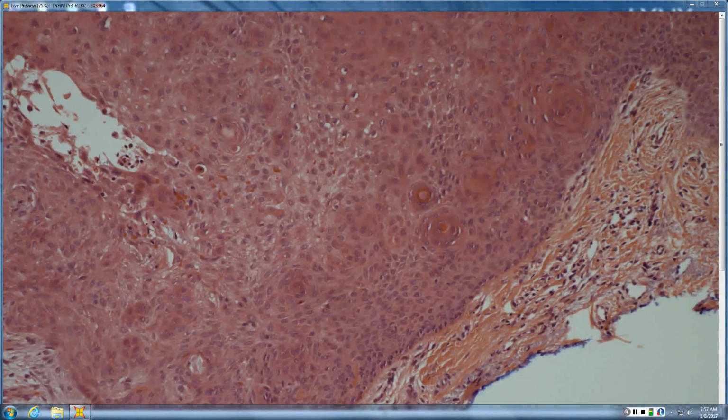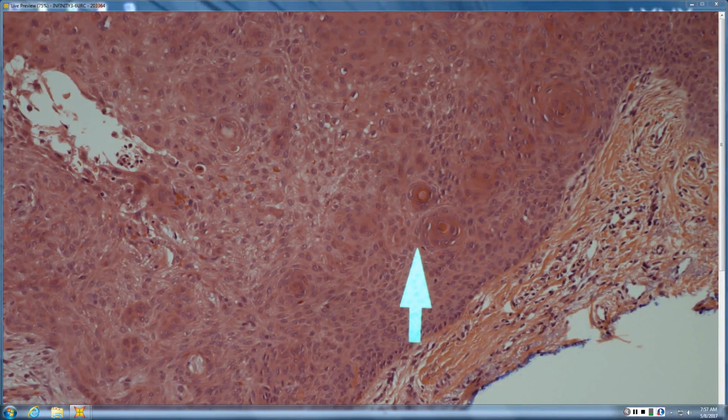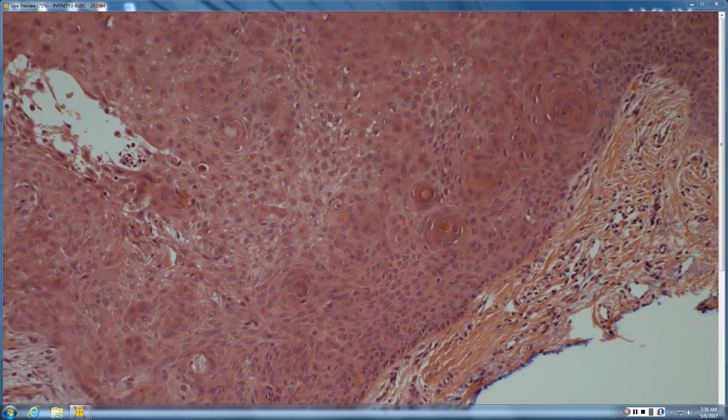You did extraordinarily well. You landed right on what the two possible diagnoses were here. You see a little bit of outer root sheath differentiation with glycogenation, which is why you thought trichilemmoma. And then you have the squamous eddies. You can see that both in IFK and trichilemmoma, both are endophytic lesions. What this is lacking for trichilemmoma is the thick vitreous membrane and the peripheral palisade. So it's better for IFK, inverted follicular keratosis.